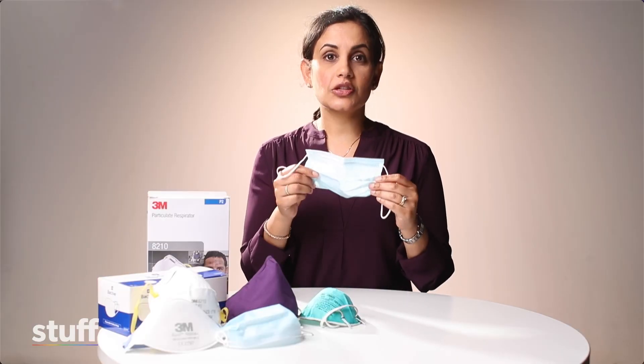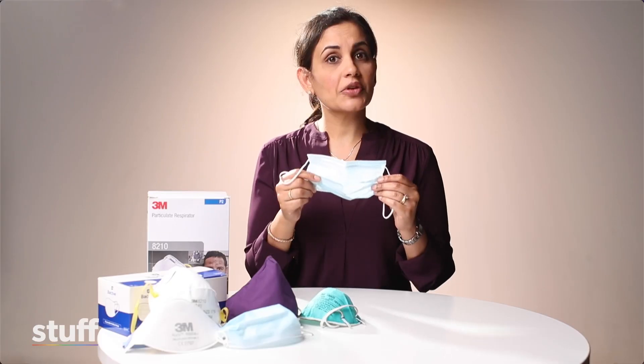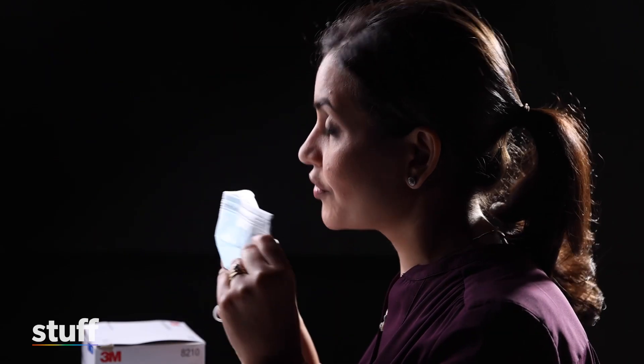The good news is a surgical mask provides very good protection. The main difference between a P2 N95 mask and a surgical mask is actually the fit of the mask as opposed to the filtration. So I'm going to show you three very easy hacks whereby you can improve the fit of your surgical mask.